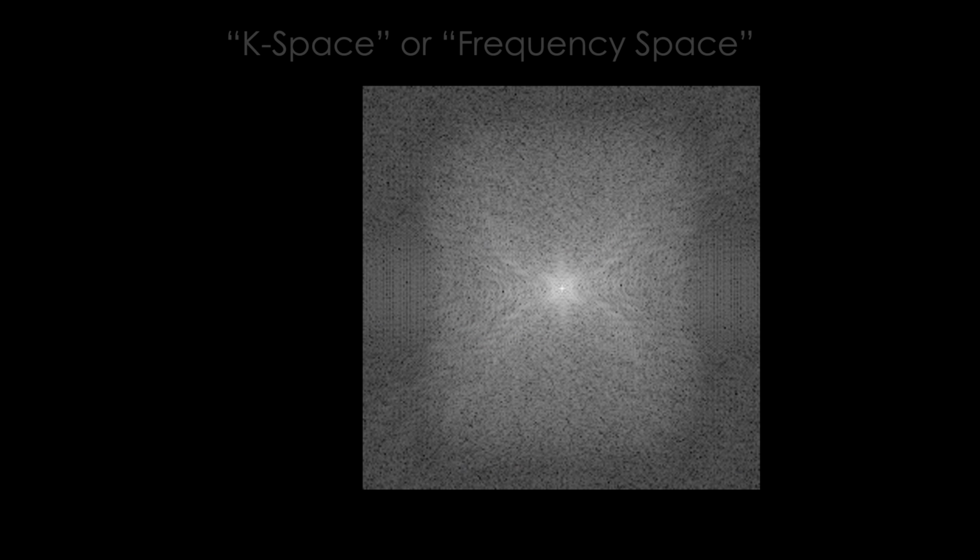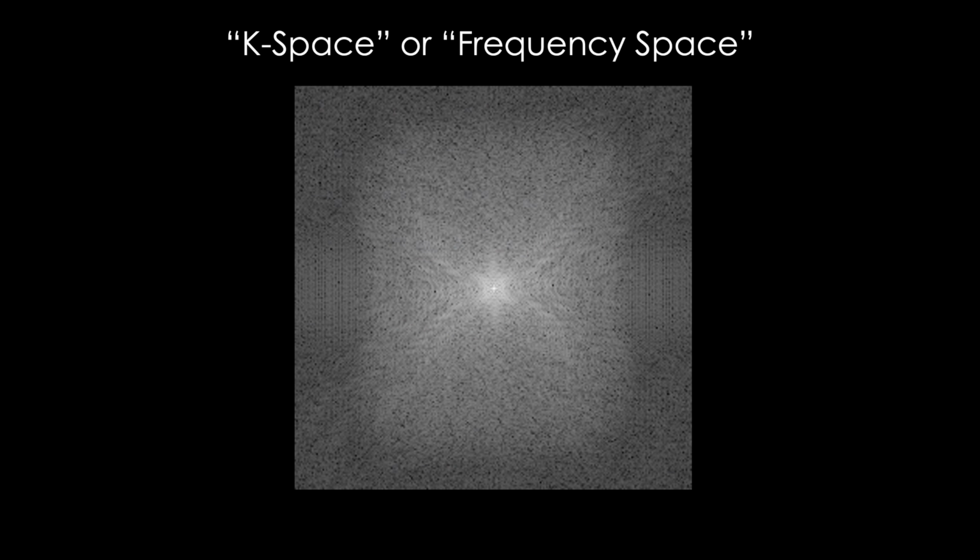So this is how we get the infamous picture of K-space, or frequency space as they call it, a visual tool that makes it easier for us humans to visualize our recorded signal strength, which will be determined by our pulse sequence technique and the gradients and amount of dephasing they cause. But notice that knowledge is somewhat lost in this picture.